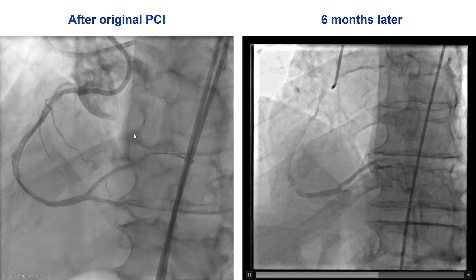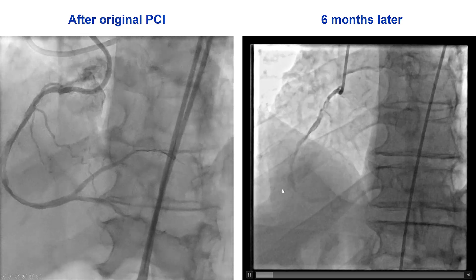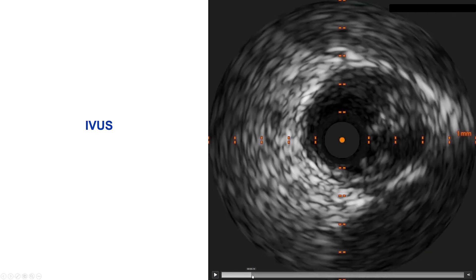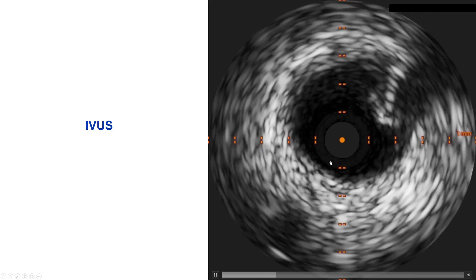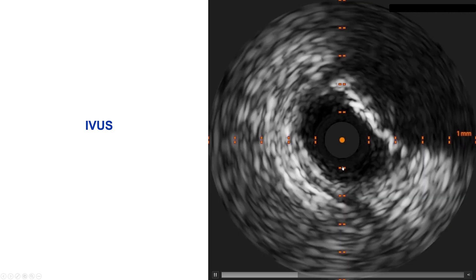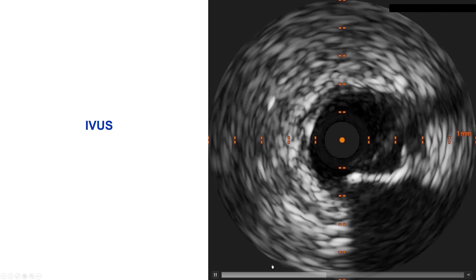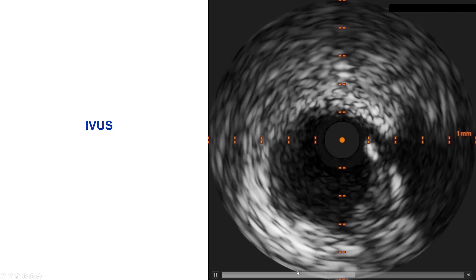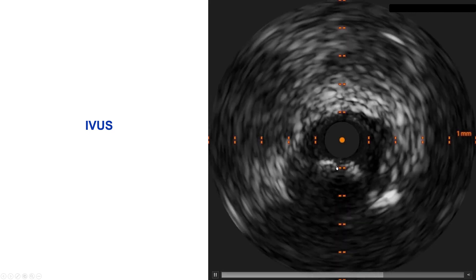This is a remarkable improvement. The dissections have extensively healed, although there remains a small area of dissection. This is the intravascular ultrasound, which demonstrates that the vessel has successfully re-canalized. There are still some areas of stenosis. There may be some areas of residual dissection, and there are also areas of calcification. However, for the most part, the vessel has healed and actually increased in size.